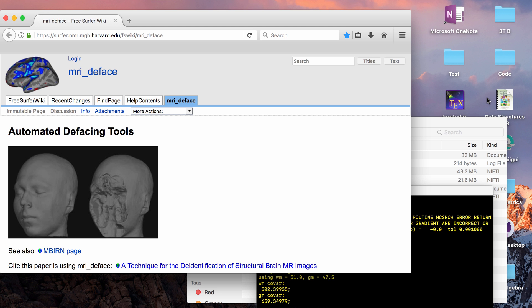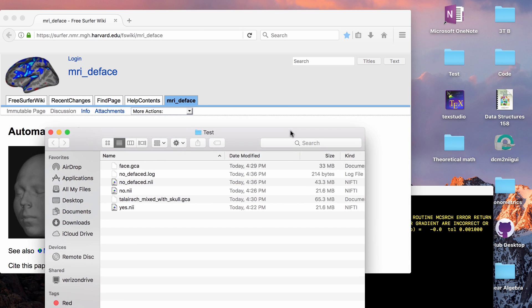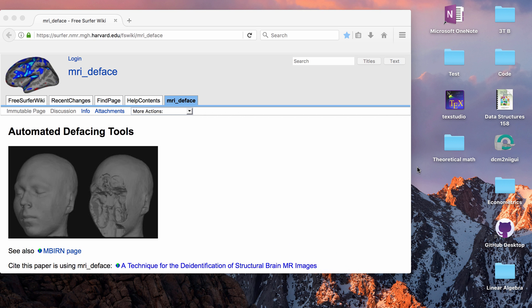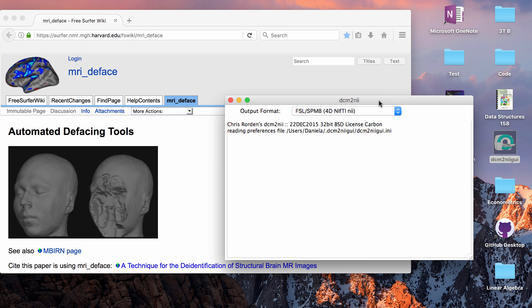To start off, I'm going to talk about de-identification. You can strip a lot of the header that has personal information from DICOMs and NIFTIs using MRI-Cron. MRI-Cron has a tool called DICOM to NIFTI and also DICOM to NIFTI GUI and this can let you anonymize really simply DICOMs and NIFTIs.